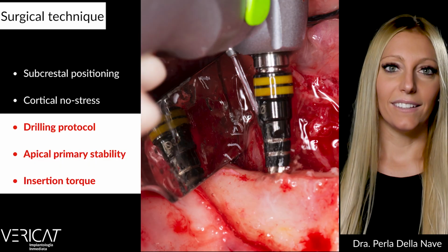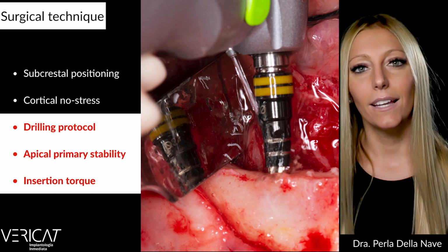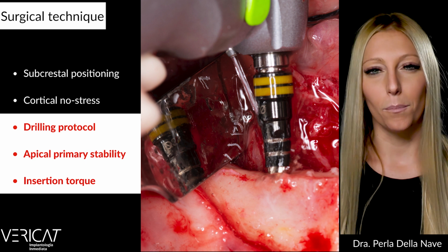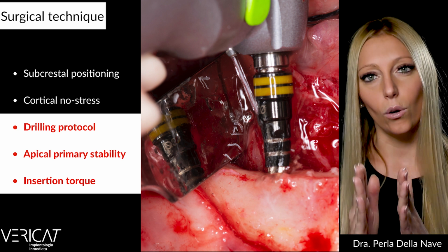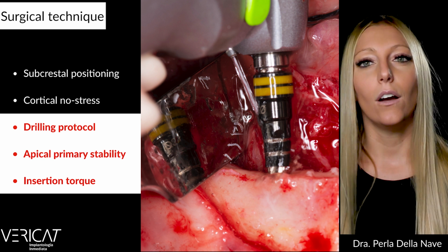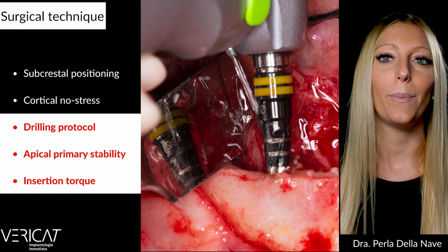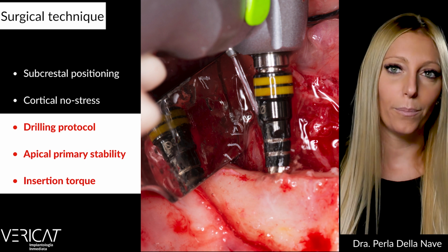So what about drilling? Drilling must be adequate, unaggressive, minimally traumatic, especially in normal to compact bones. And let me explain some tips about the drilling protocol in our implant system. Compact bone drills, which are parallel, non-conical drills, can be used or not, can be used at different depths or with a different diameter according to the bone density, but always must the cortical portion be prepared and left totally tension-free using a special drill, which is called pilot drill.